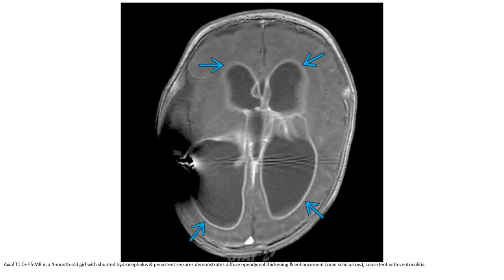T2-weighted MRI in a four-month-old with shunted hydrocephalus and persistent seizures. There is diffuse ependymal signal and enhancement, consistent with ventriculitis.